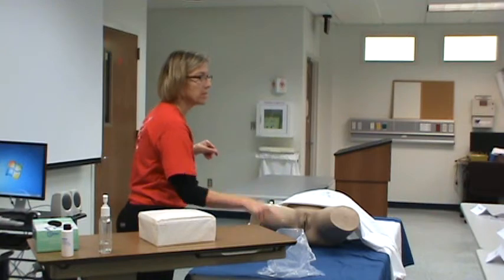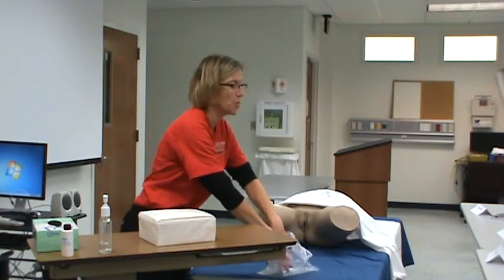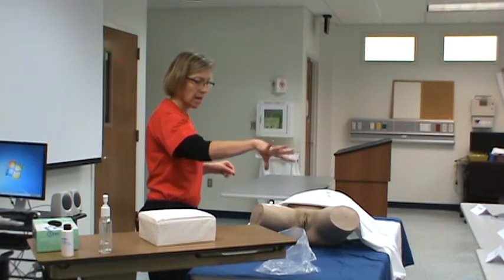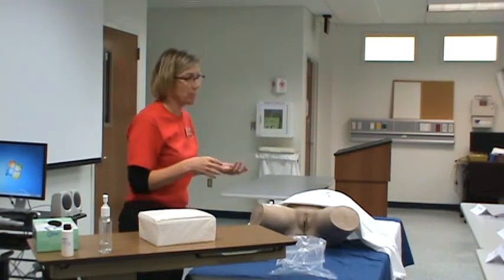Touching it. Yeah, I have seen students touch the inside of their bag. So you have to make a choice whether you want to do it, and it's how you practice, and that's fine, but make darn sure that you're dropping it, and you're not even coming close to that bag if you're choosing to use the bag. Because I'll show you another thing you can do when I get it set up.